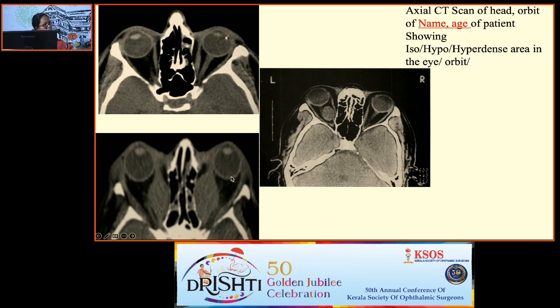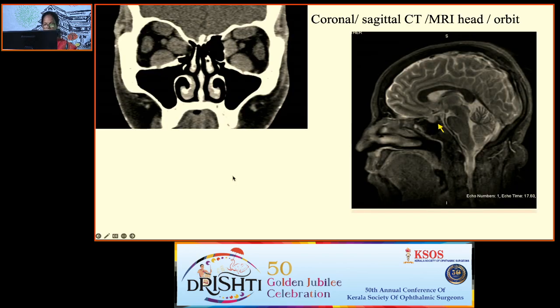Differential diagnosis? Okay, thyroid. Here also this is the coronal section showing enlarged extraocular muscles. So this is also thyroid. This picture you can see the pituitary gland. This is an MRI picture, which is T1 or T2 weighted? Here you can see the CSF. Black. Black. White. Okay. So can you see a tumor here? This is a pituitary tumor pressing the chiasma.